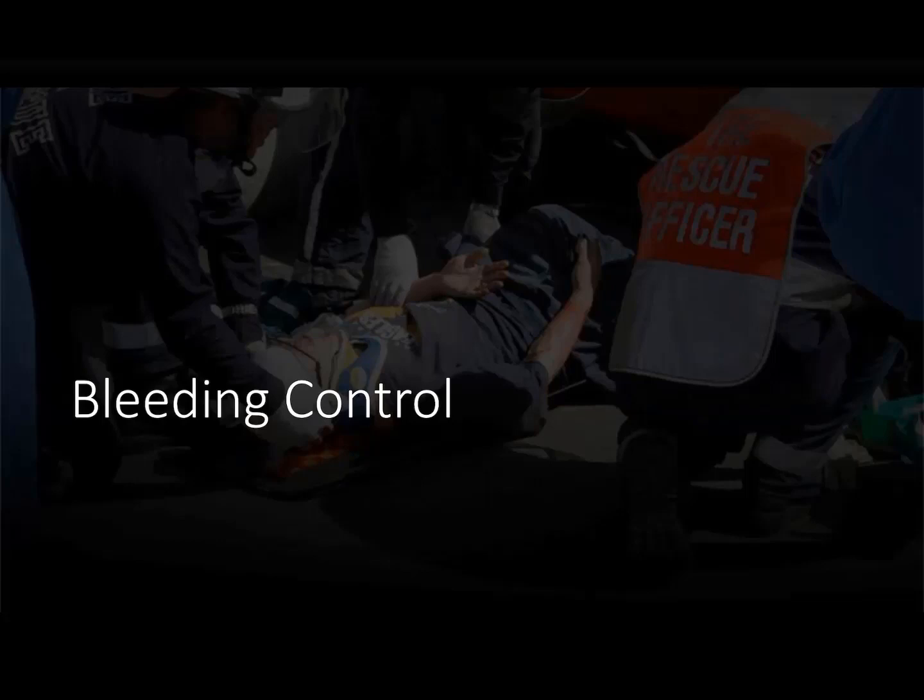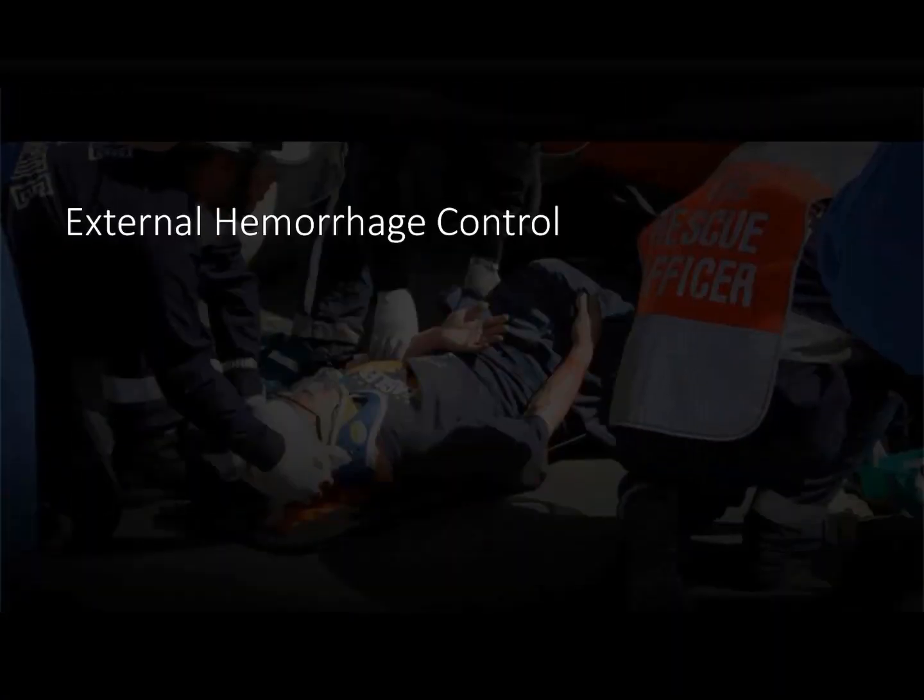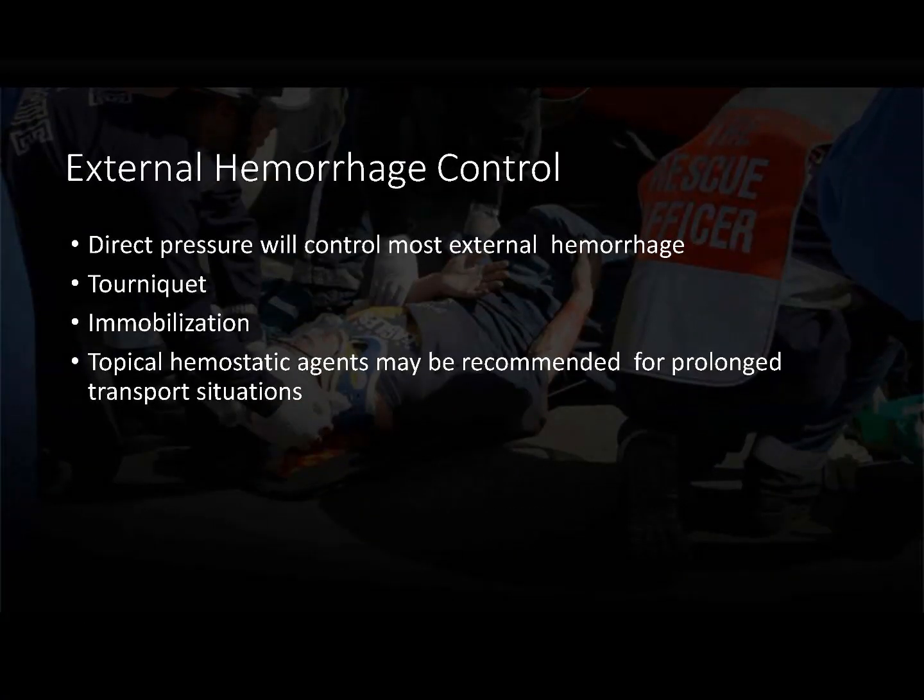Let's explore some of the bleeding control mechanisms and devices that are available to the paramedic and outlined in PHTLS's 9th edition. You know, back in the old days, I guess, if you will, we actually didn't have tourniquets associated with our care. There weren't any commercial available tourniquets, and we were actively told not to utilize tourniquets if we could avoid it. So in those days, we had things like direct pressure, which we still utilize, followed by elevating an extremity and trying to hold manual pulse pressure at a large blood vessel, say in the axillary region for an upper extremity bleed.